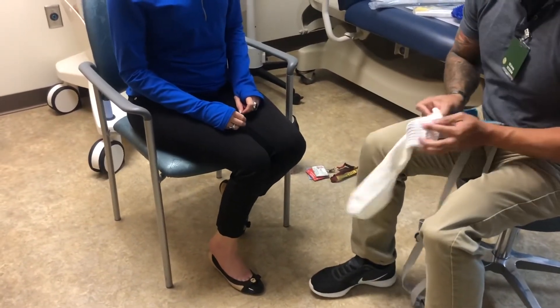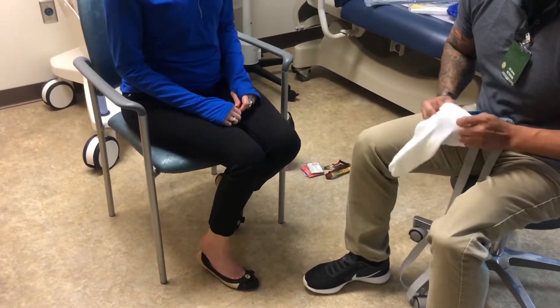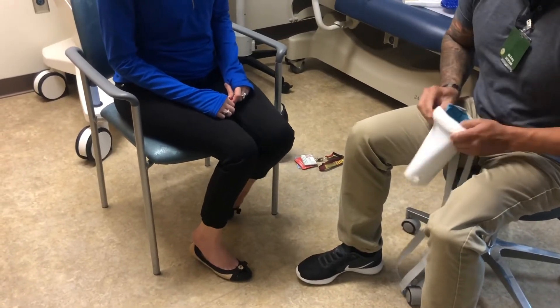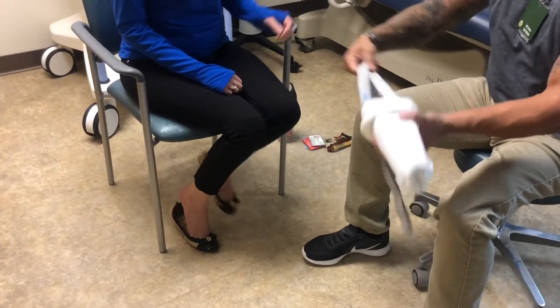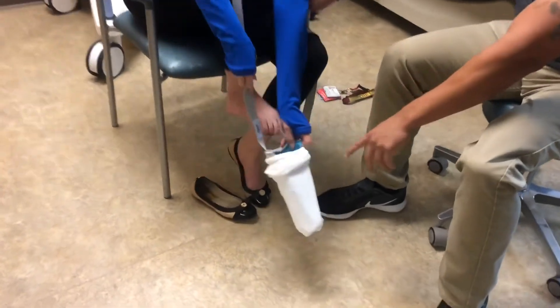For the use of the sock aid, you want to go ahead and slide the sock three quarters of the way up, making sure the end of the sock is at the very bottom of the sock aid. After that's done, you're going to go ahead and place the sock aid on the floor and use both straps to slide your foot in and pull up as you put the sock on.